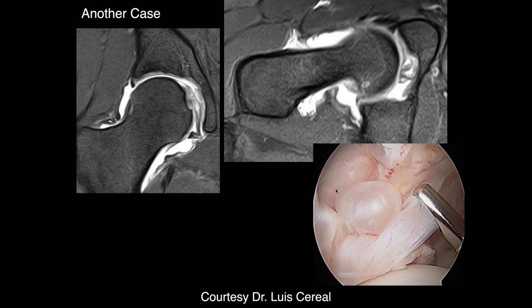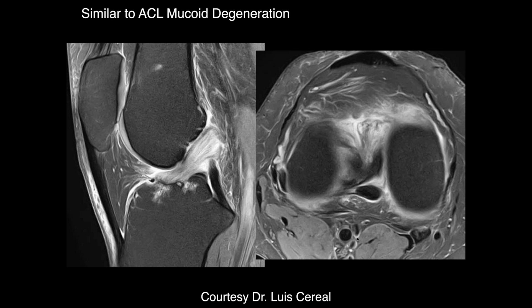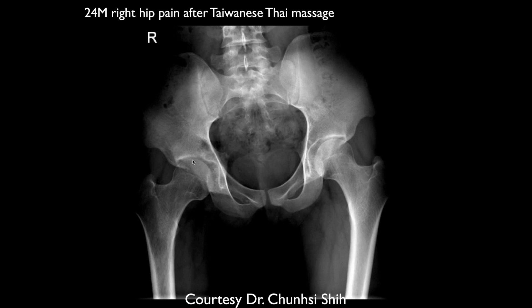Another case demonstrates abnormal signal intensity within the ligamentum teres consistent with chronic degenerative tearing. These ligamentous changes are similar to what is seen throughout the body — the mucoid degeneration resembles that seen in the anterior cruciate ligament. It is essentially the same pathology as ACL degeneration.